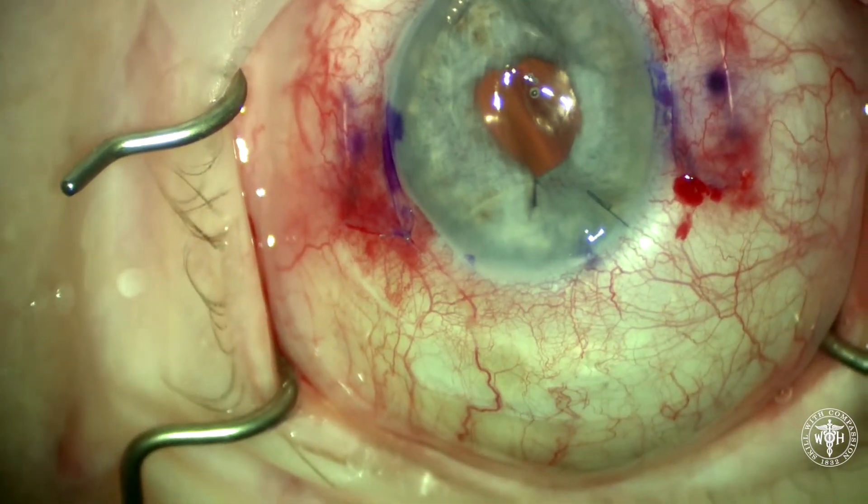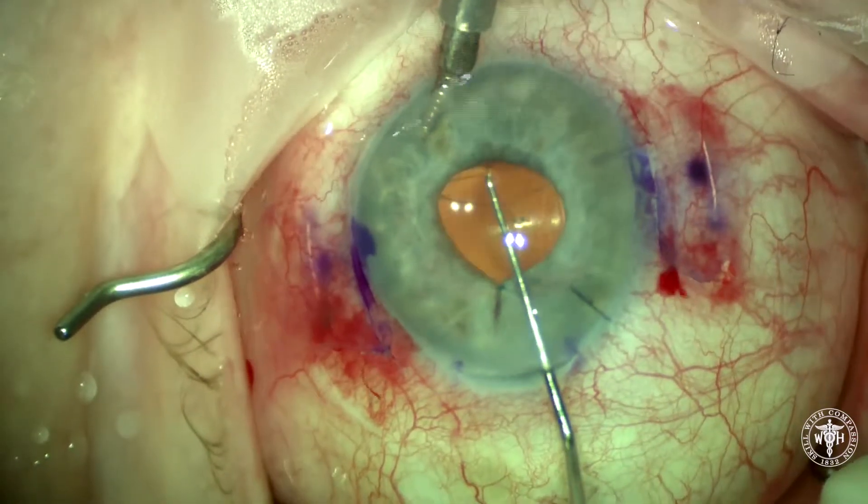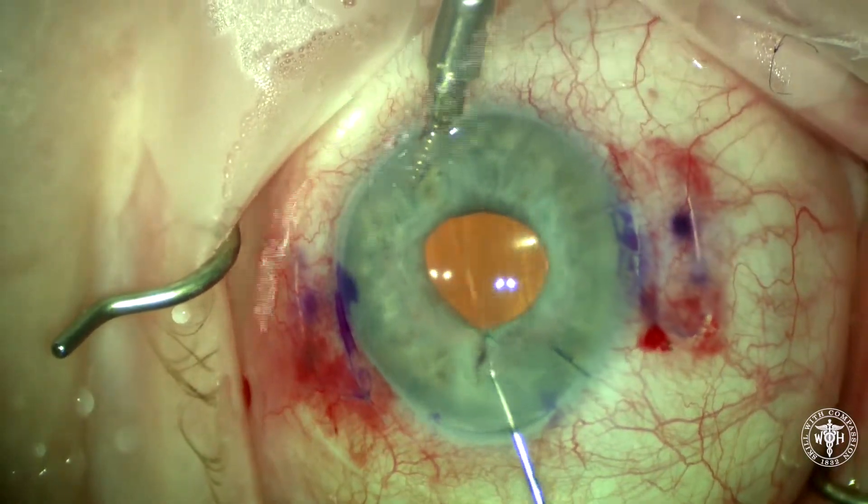Once that knot is tied, we'll cut the ends, and now we have a well-centered IOL and a smaller pupil.